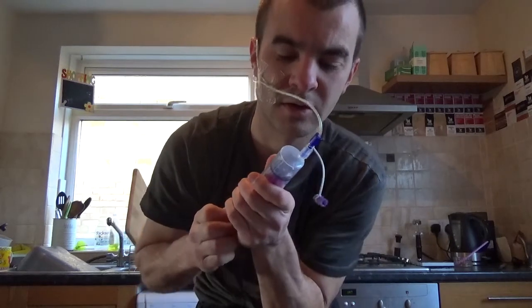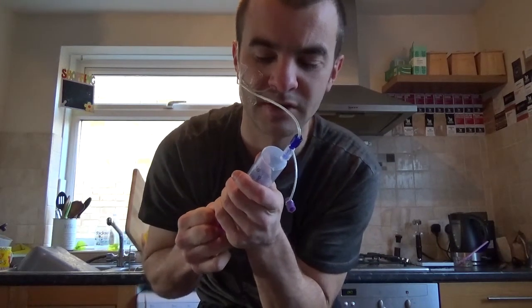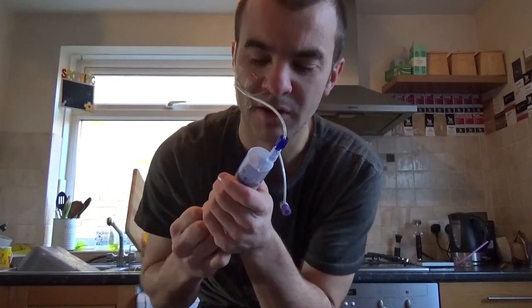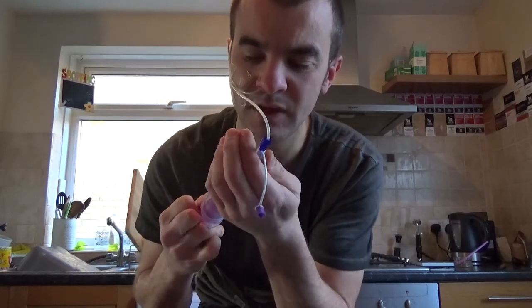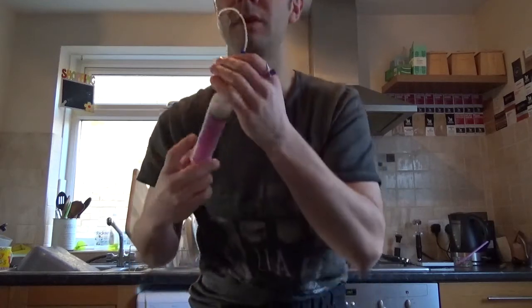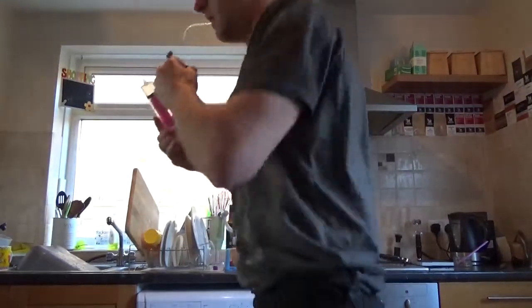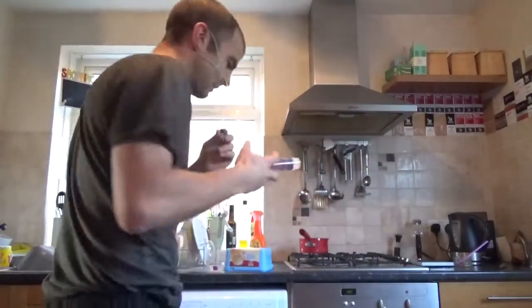Then we pull back, and hopefully — this is my first attempt of the morning, and this happened the other morning as well. I'm guessing because I'm quite dry, I get nothing back. So what I might do is jiggle around a bit and see what happens.